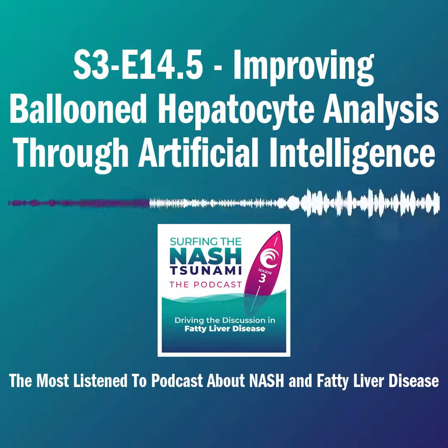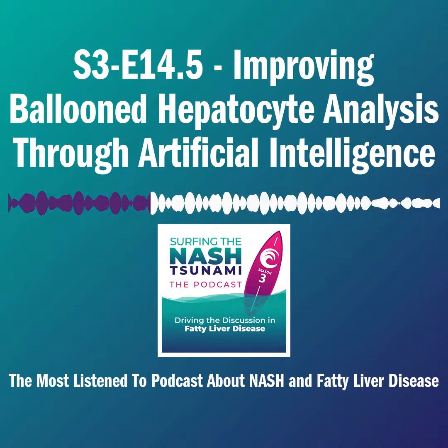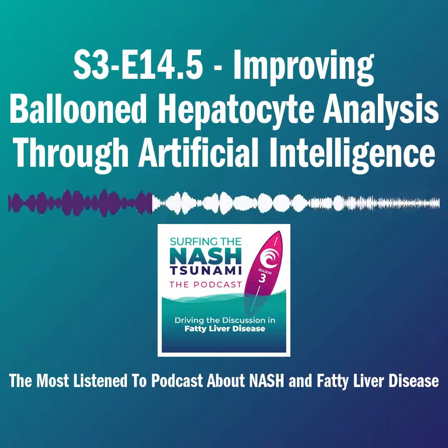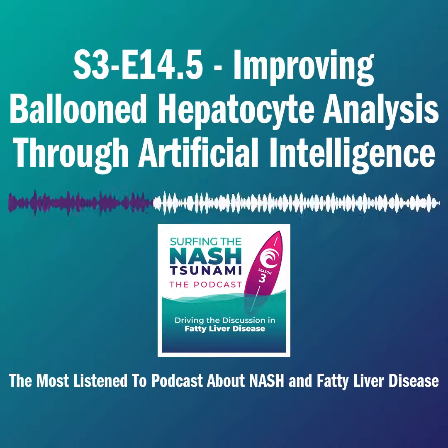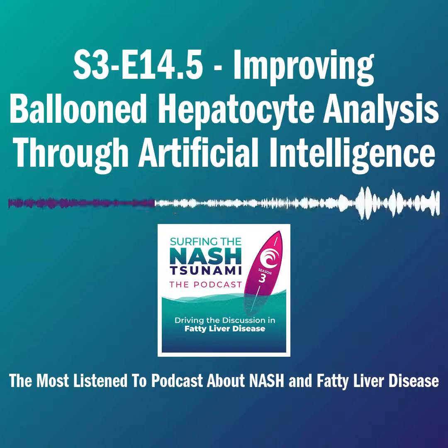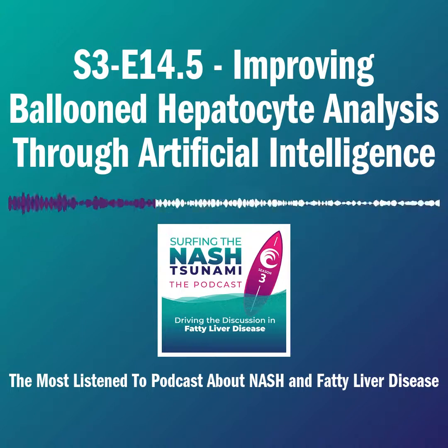Obviously, Mazen, there isn't a right answer to the question. What we've demonstrated is that the more pathologists who agree that a given cell is ballooned, if you use only the cells where, for example, 7 pathologists all agree that they're ballooned, to train an algorithm, and this is what Dean modeled very elegantly, you will find that the algorithm is potentially more specific, but less sensitive. Whereas if you train it with every cell that any pathologist thought might be ballooned, you then have an algorithm which is much more sensitive, but much less specific.